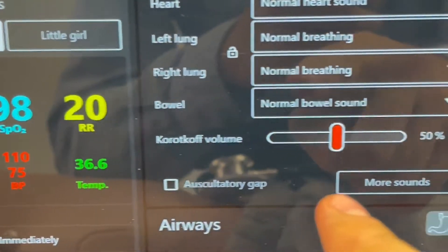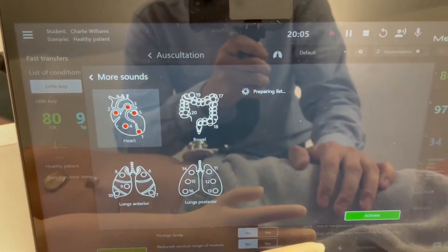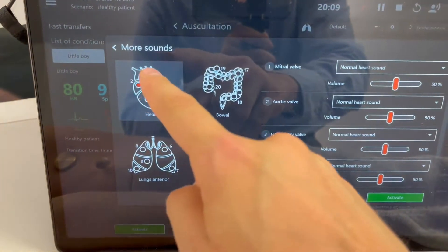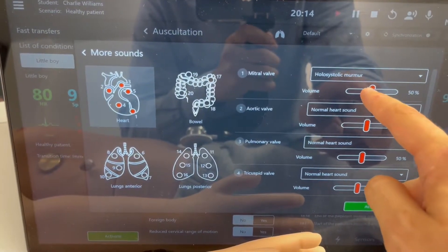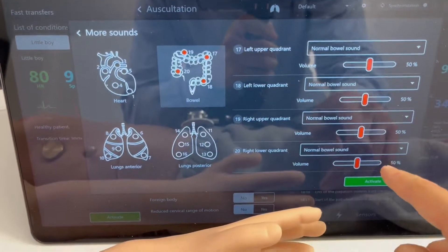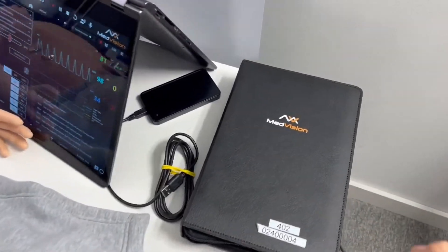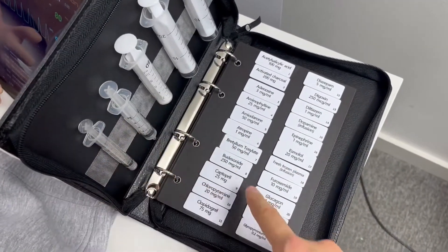Also new is the auscultatory gap feature. If you press 'more sounds,' those familiar with Med Vision software will know you can now configure each auscultation point individually for something more custom. You can also configure the volume, then configure the rest of your points and press activate — so now you have a custom preset on the auscultatory.